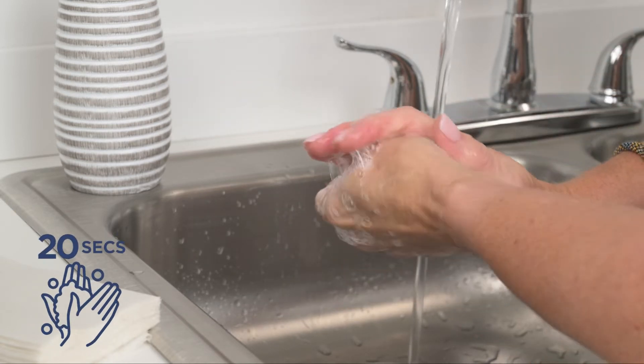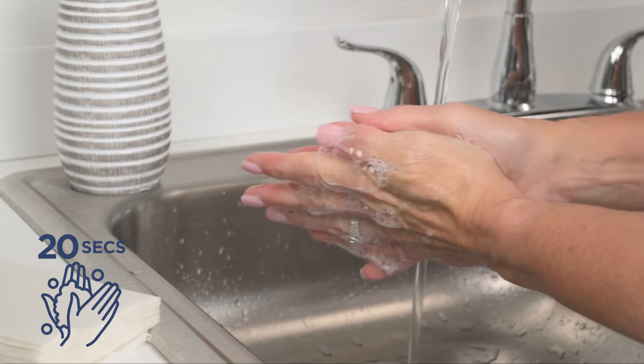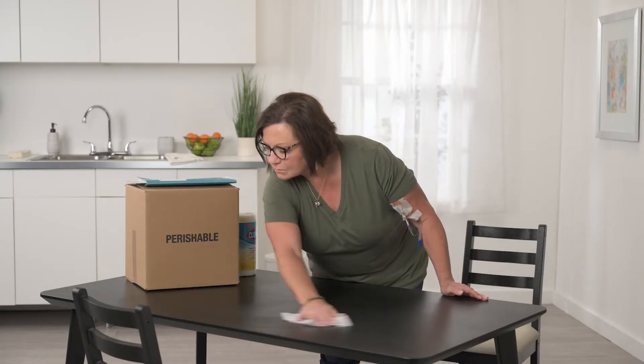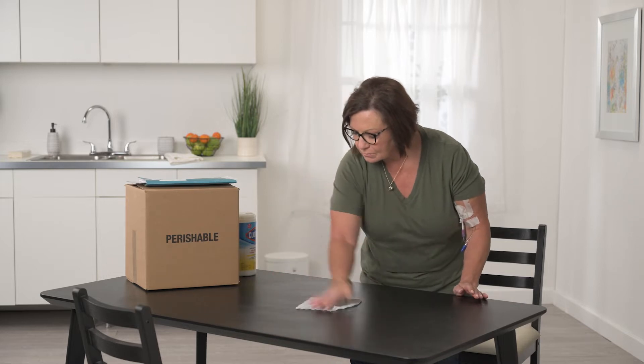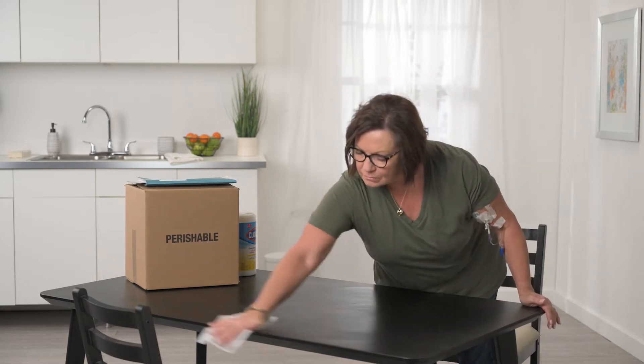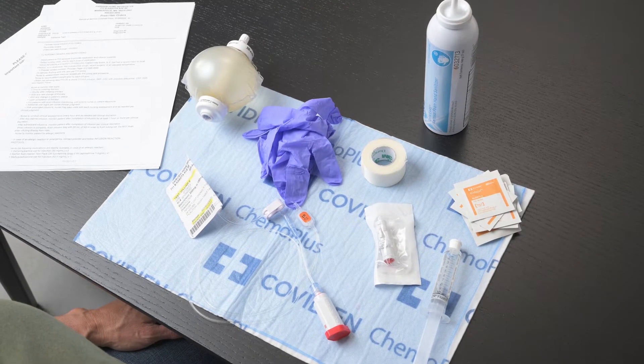Before getting started, wash your hands with soap and water for 20 seconds or use a hand sanitizer. Identify the area you will be working at. Choose an area that is flat and can be cleaned with soap and water or disinfectant. Clean the surface and let it air dry.